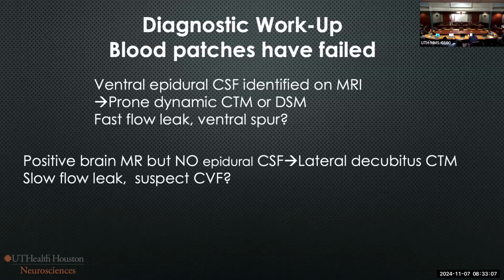So I think the answer is you do an MRI first. You do the MR myelogram. Then we do always have to do a CT myelogram. In the dynamic aspect of the myelogram, we actually see the injection. But if that doesn't work, it has to be at another time.